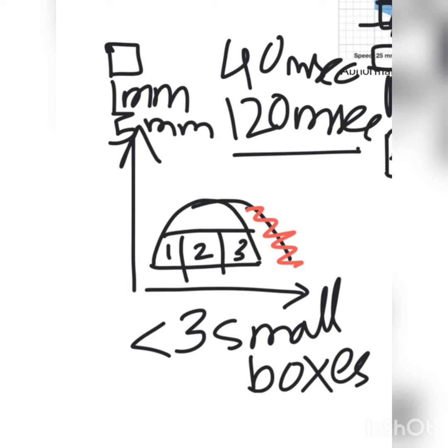As I am discussing limb leads and precordial leads, I want you to know about them. So the limb leads are lead 1, limb lead 2, 3, then AVR, AVL and AVF.